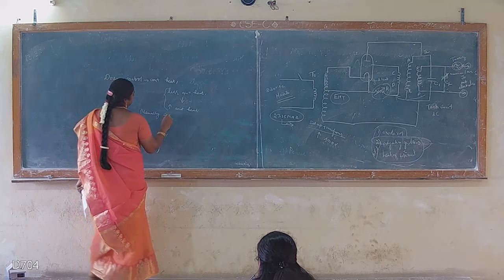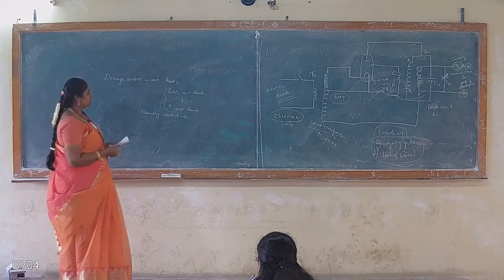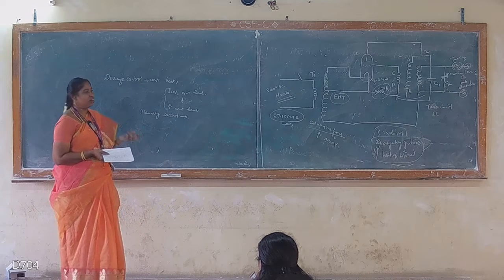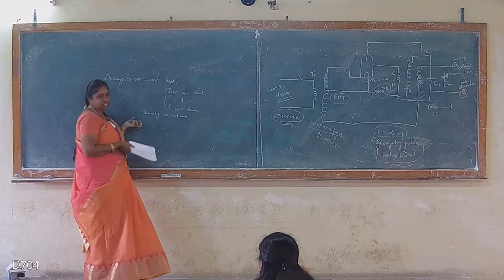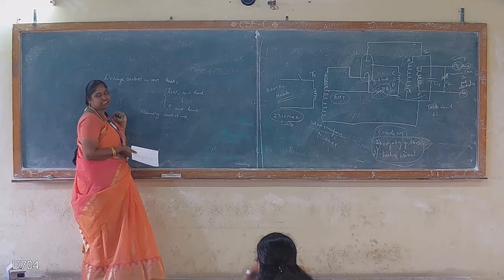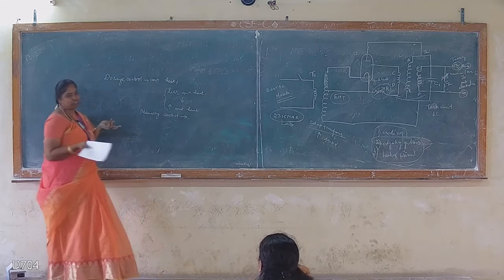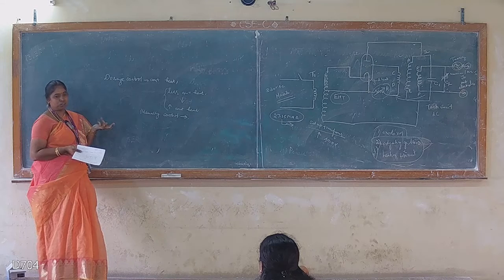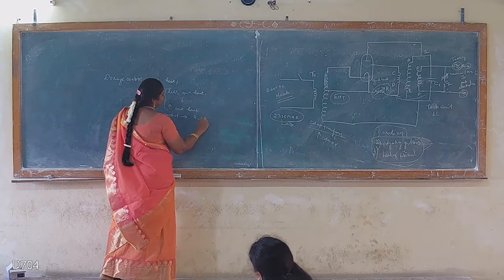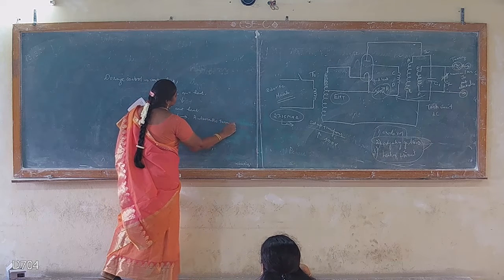Manual control is not advisable, because where a low dosage is required, if the physician or the attendant wrongly applies a higher dosage, tissue damage may happen. Sometimes it can even extend to damage of the bones. So the tuning should always be done automatically. That is, automatic tuning is required.